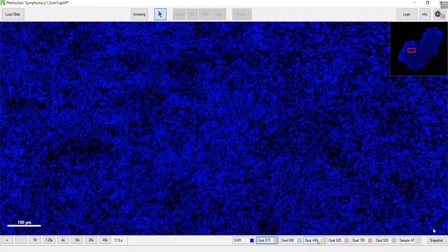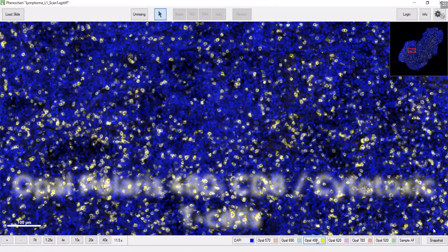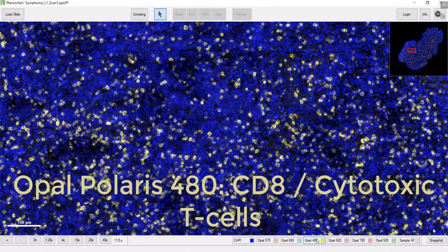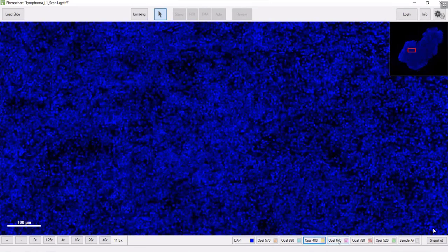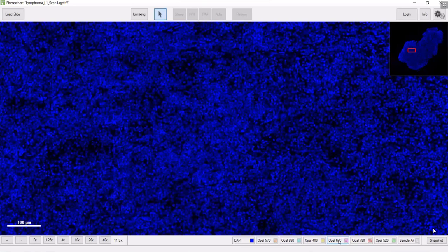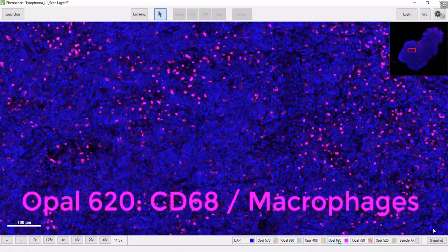Another marker is CD8, the cytotoxic T-cells. And we have a macrophage marker, CD68.